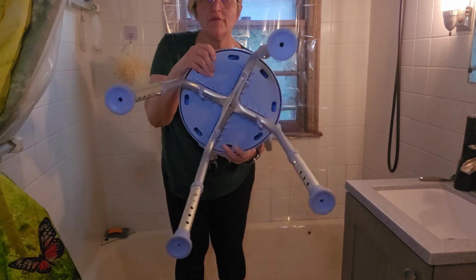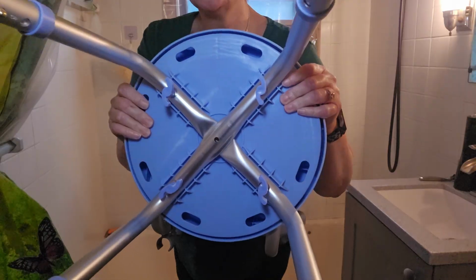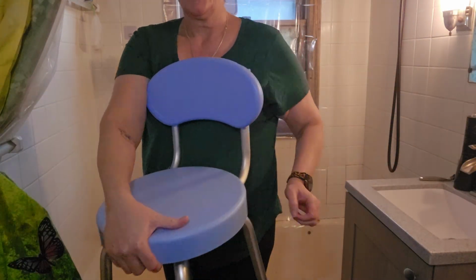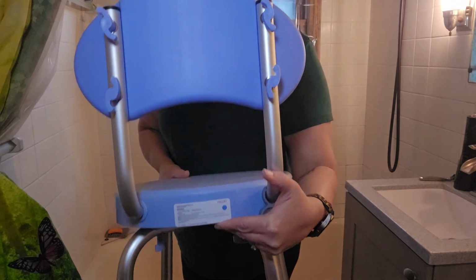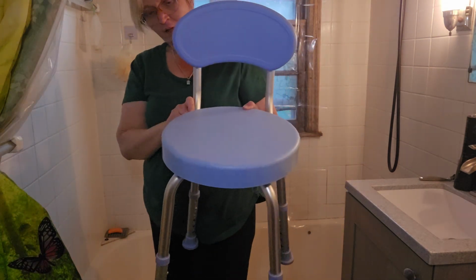It took all of a matter of 8 bolts to put this together. So you've got your 4 in the bottom here. That's what these are. And then you've got the 4 in the back. This literally took me 5 minutes to assemble.